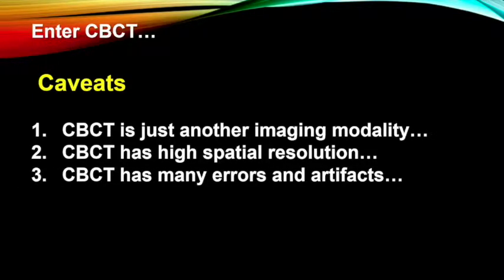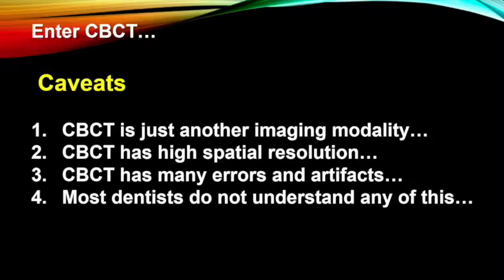CBCT has many, many errors and artifacts. And by the way, minor movement in a CBCT scan will disrupt some of the information that you get. So you have to have something that fixes the patient's head very stationary. And most dentists don't understand any of this. That's the biggest problem.